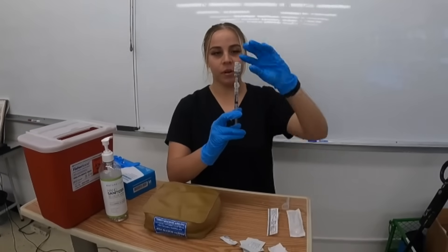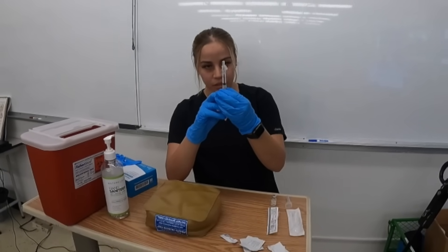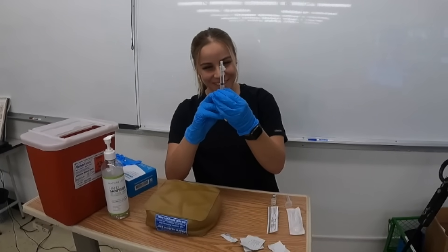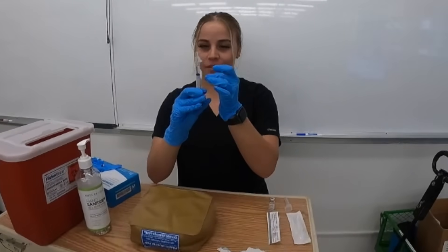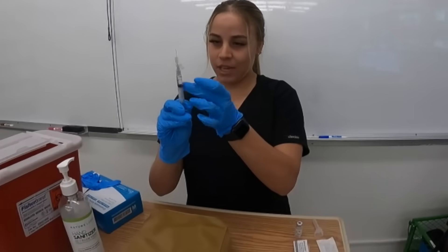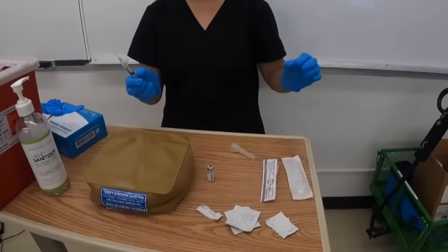Now that I've drawn up all my medication, I'll take the vial off, confirm I have one milliliter of medication, remove any air bubbles, and use the scoop method to recap the needle.